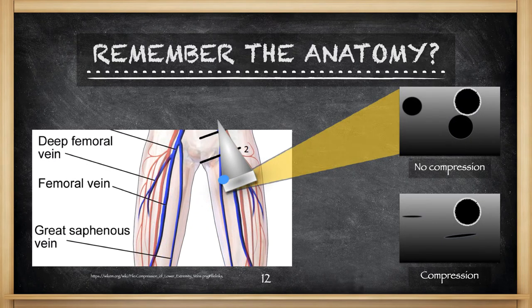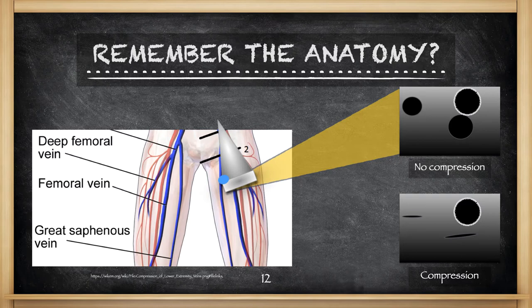As you migrate down the leg, you may find that the vein traverses behind the artery, so when you compress, the artery will remain full and plump and pulsatile, and the vein underneath will compress. You can also see that the saphenous vein is migrating farther away from the artery and vein. As you compress these, you should get complete and total compression of the veins — the anterior wall and the posterior wall should meet.